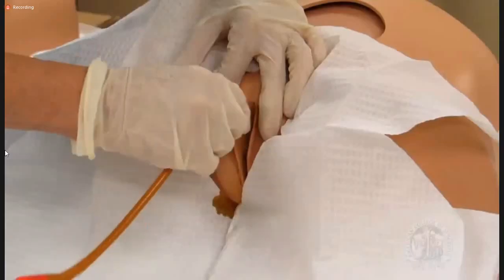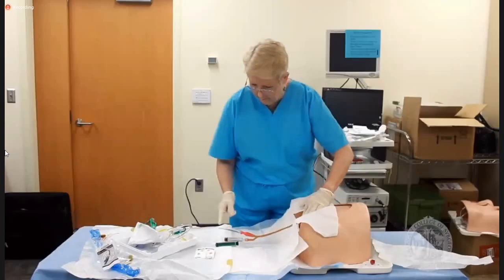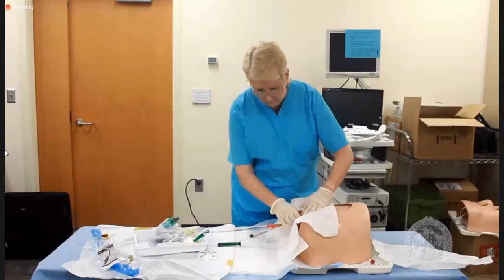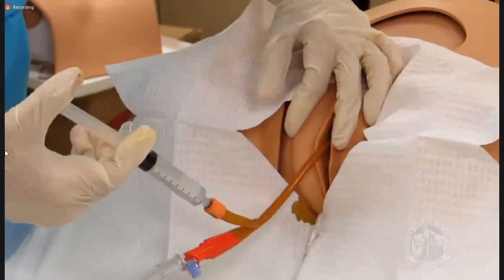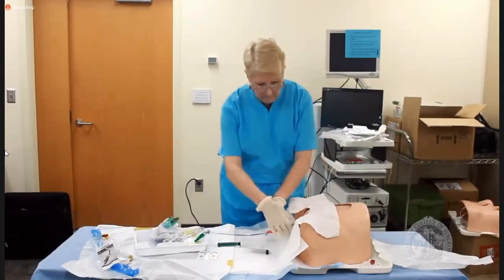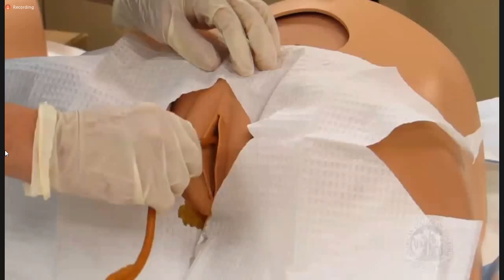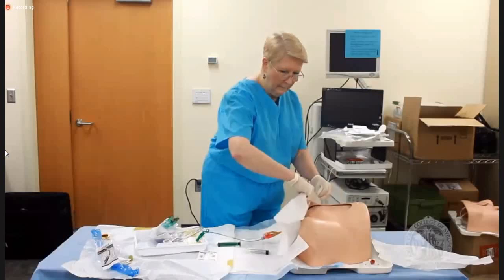When placing bladder catheters in patients with a vulva, advance the lubricated catheter until urine is seen in the tubing, and then advance another 2 to 5 centimeters before instilling saline into the balloon. Once at the correct depth, instill the correct volume of saline into the balloon and gently pull back on the catheter until resistance is met. Re-advance the catheter 2 to 3 centimeters so the balloon is not putting pressure on the bladder neck. Remove the drape from the patient.